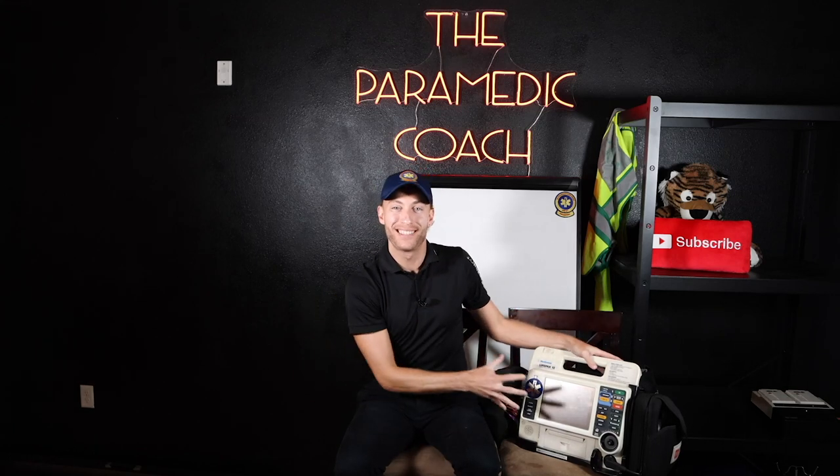Hey everyone, it's the Paramedic Coach. Fun video for you today. I'm going to show you exactly how to go through and understand how to use this LifePak monitor. LifePak is one of the most common cardiac monitors we find in EMS. Let's learn how to use it, learn what it's all about, what's in here.